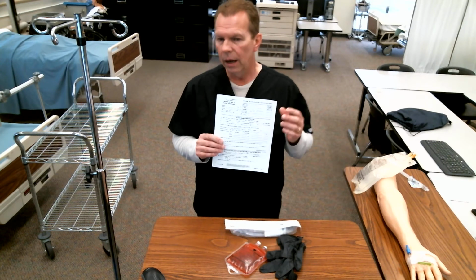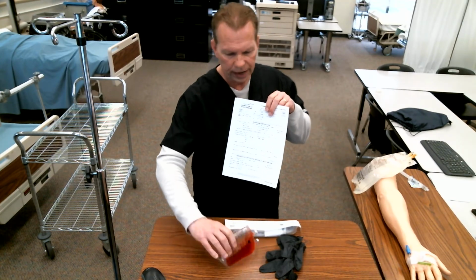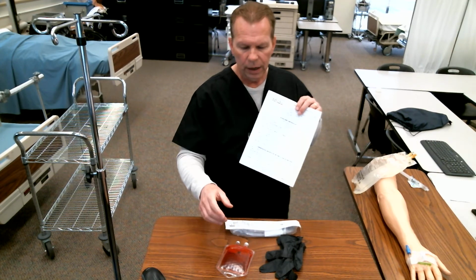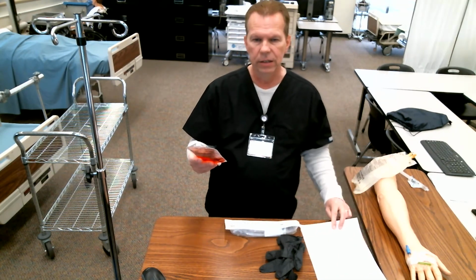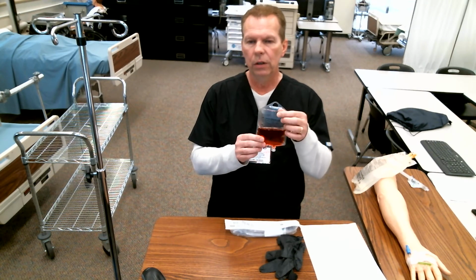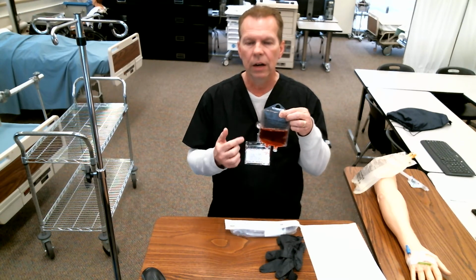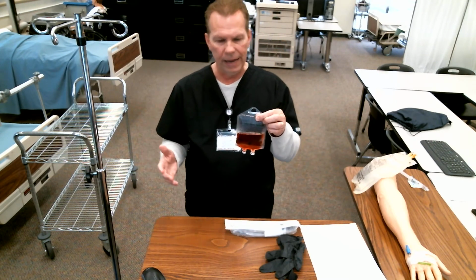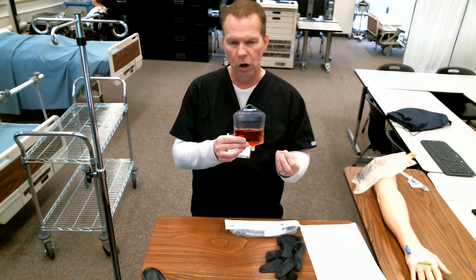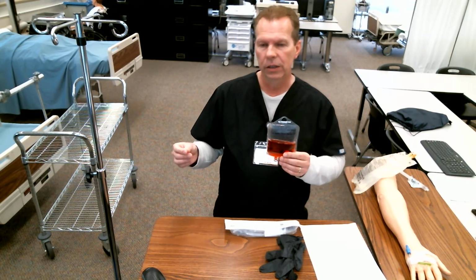All right. So once you go over that with the lab person, and both of you verify your label on your blood, and you verify that it matches this paperwork, then I want you to look at the blood and assess the quality of the blood to make sure nothing is wrong with the blood itself. So what we want to do is look for things like frothy foaminess. If you see any frothy, foamy buildup in here, you don't want to accept that blood. It's going bad. If you look at the blood and it's not a nice, rich, dark red color, but it appears to have a purplish color to it, that is an indication the blood is going bad.